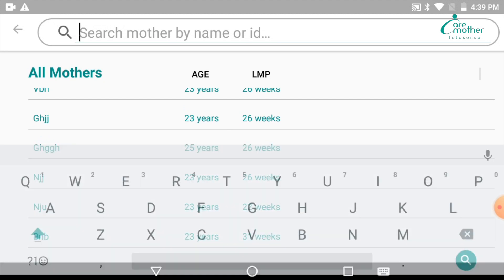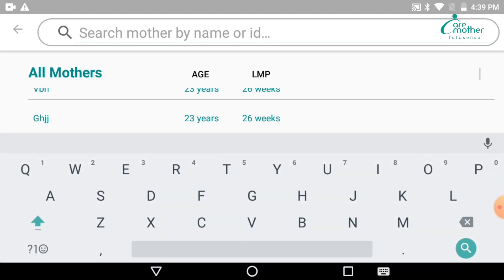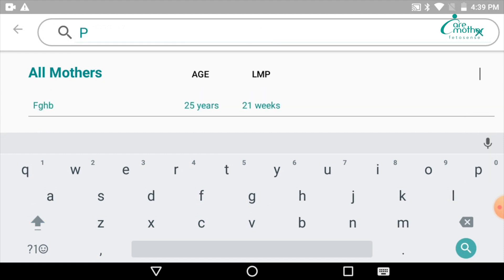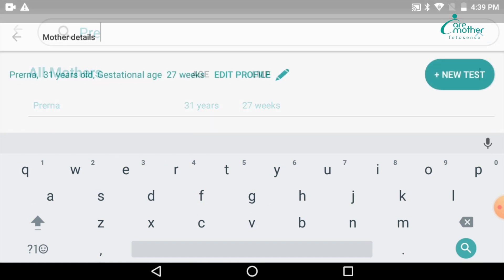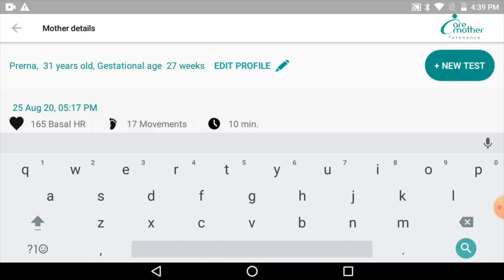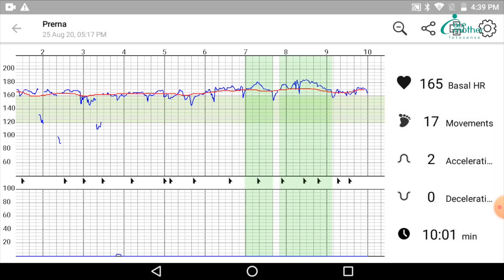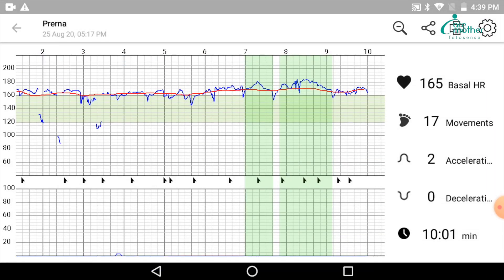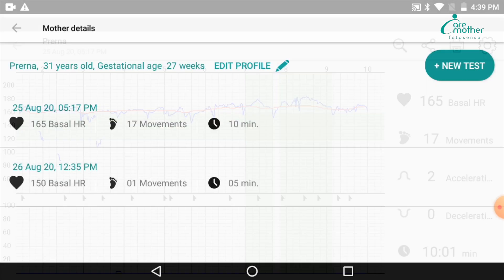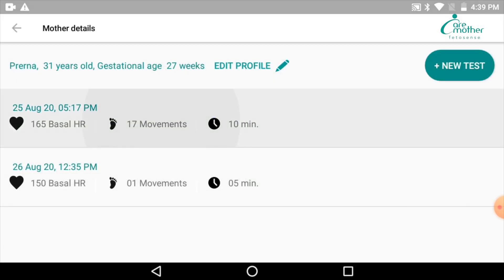To search a particular patient, you just need to type in their name in the search tab and their profile will appear. For example, I type a patient name. Her profile came up like this. I click on that profile and all her tests will come up.